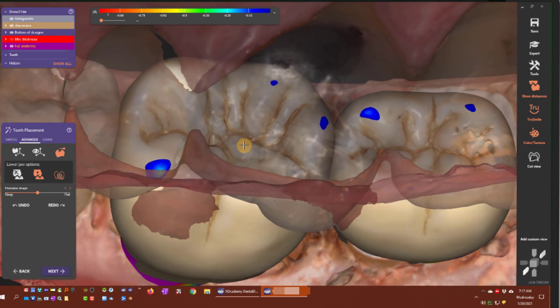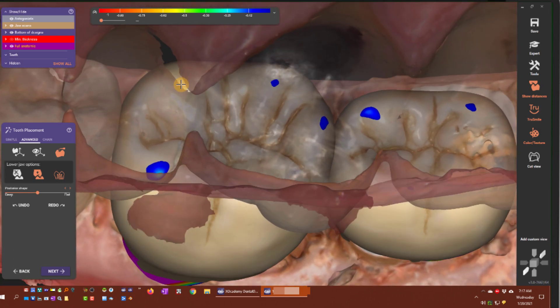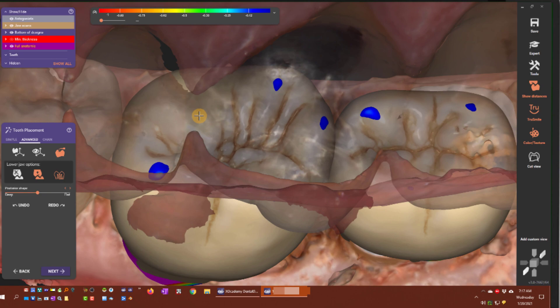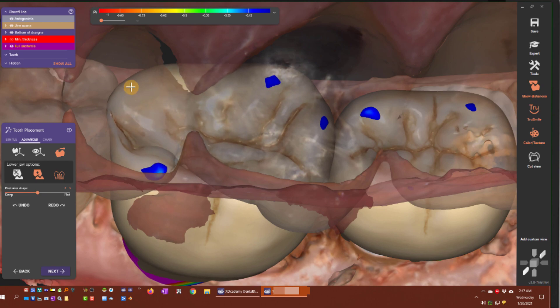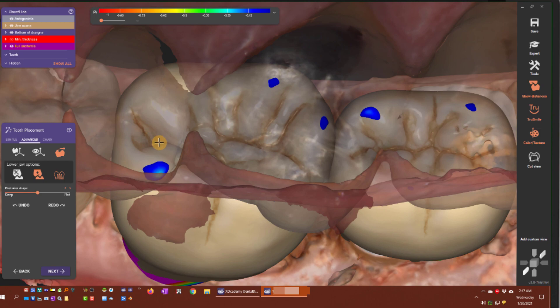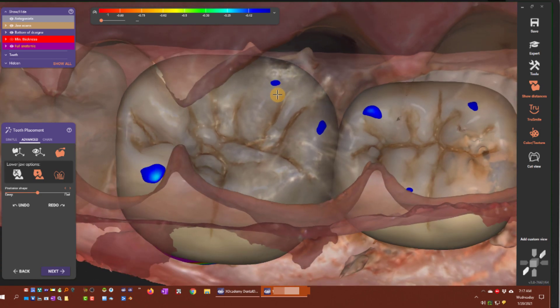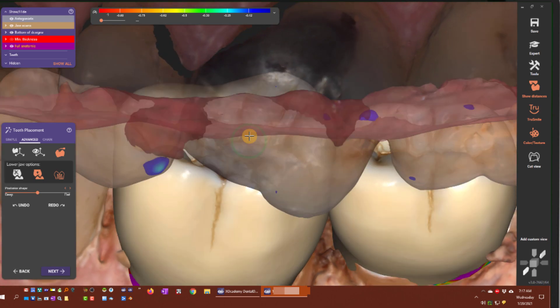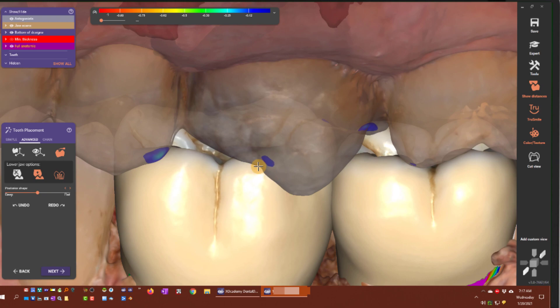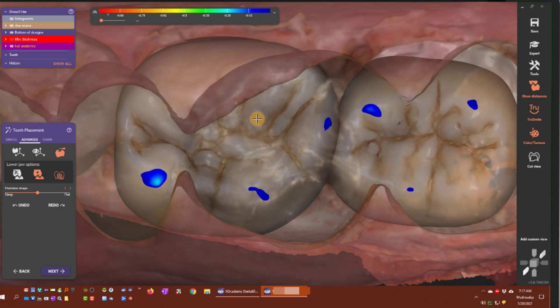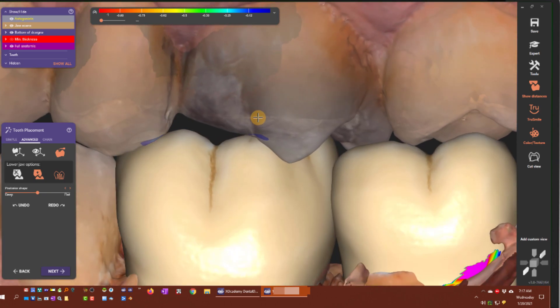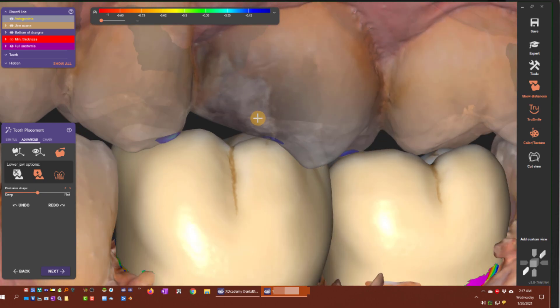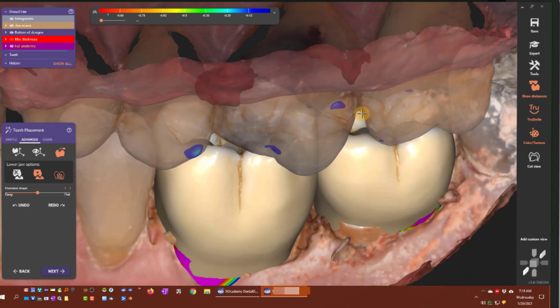Again, this is just from the tooth placement step. Maybe I want to bring this cusp in a little bit, and as I bring it in, you can see that the distal buccal cusp already adapts itself. So a very nice feature here — it makes it very easy to adapt to your occlusion without having to do a fine placement step and then go to a separate freeform step.